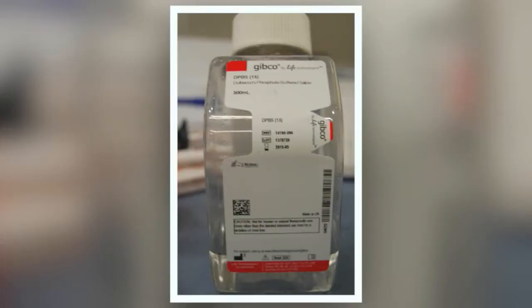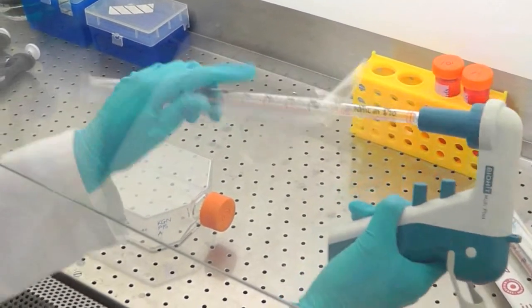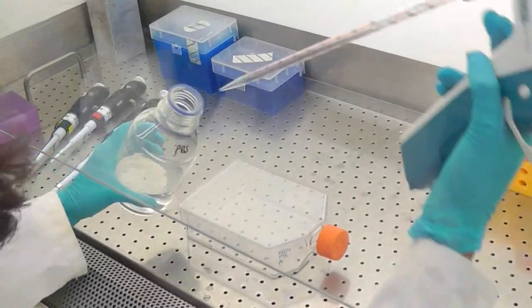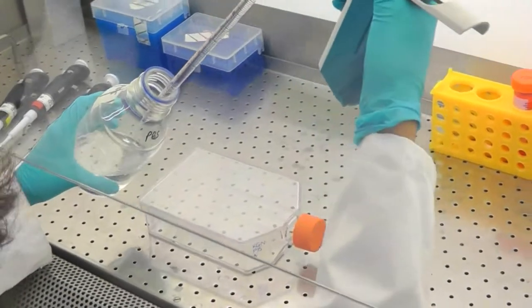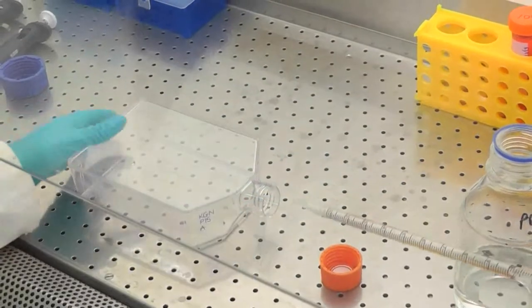Once all of the media has been removed from the flask, PBS, a buffered saline solution, is added to the cells. PBS is added using a pipette. Note that the pipette is opened under the laminar hood to ensure it remains sterile. For this size of flask, around 10 milliliters of PBS at room temperature is added in order to wash the cells and remove media and the serum.